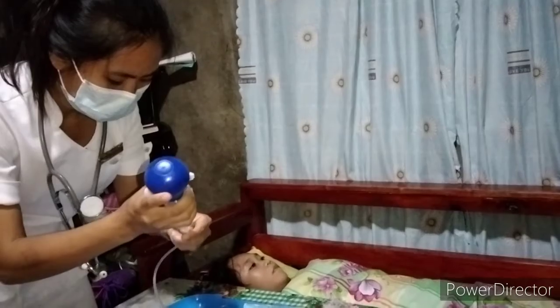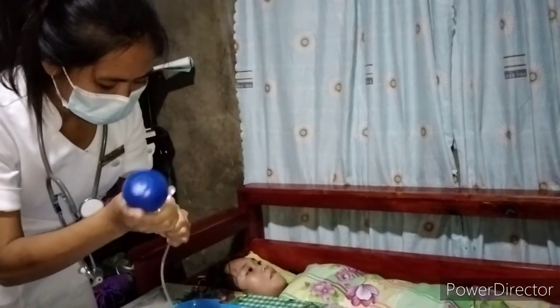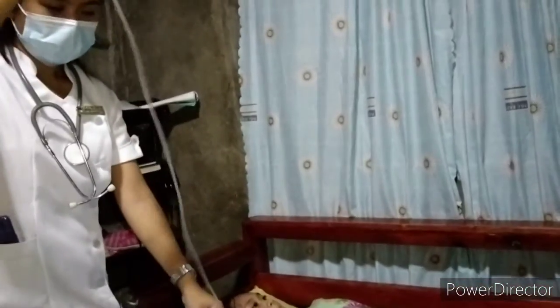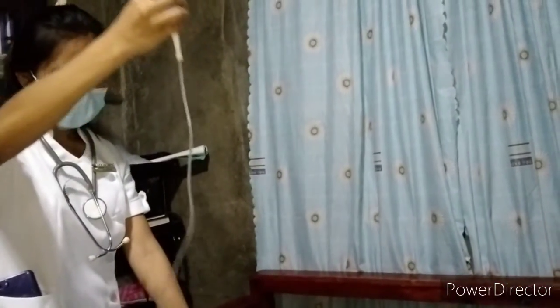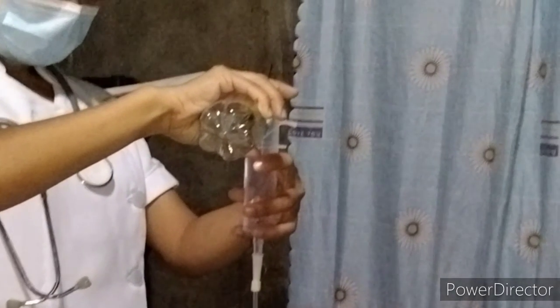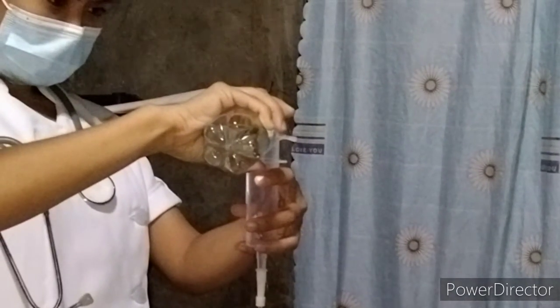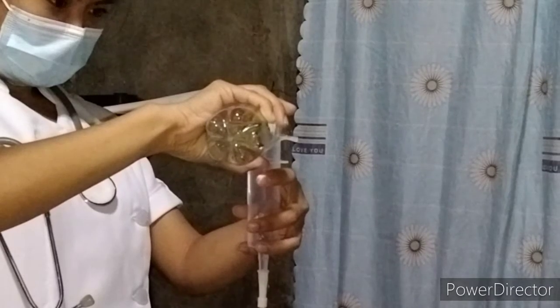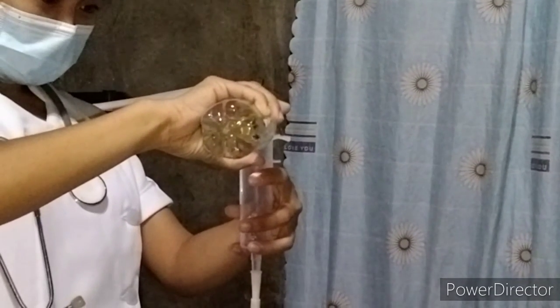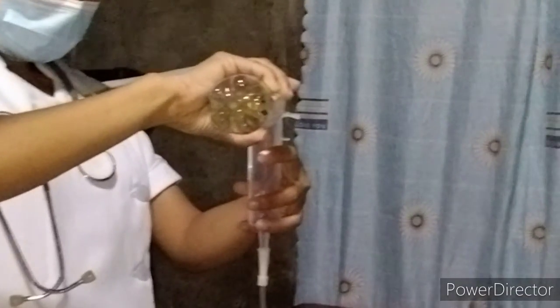Rationale: cold formula may cause gastric cramping and discomfort because the liquid is not warmed by the mouth and esophagus. Have tube feeding at room temperature. Connect tubing to container as needed or prepare a ready-to-hang container. Tubing must be free of contamination to prevent bacterial growth. Shake formula container well and fill container and tubing with formula. Filling the tubing with formula prevents excess air from entering the GI tract.